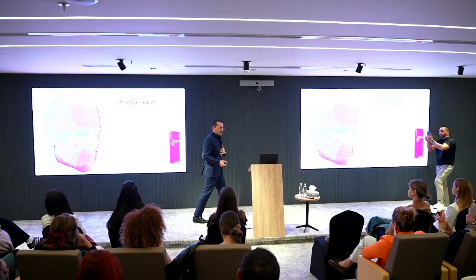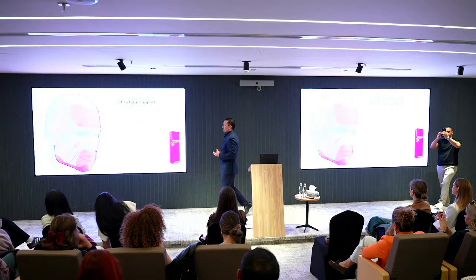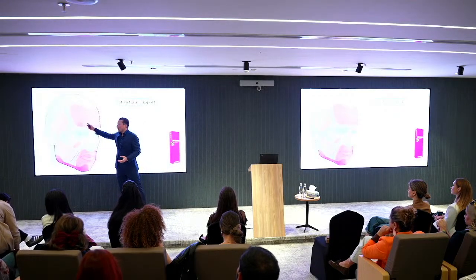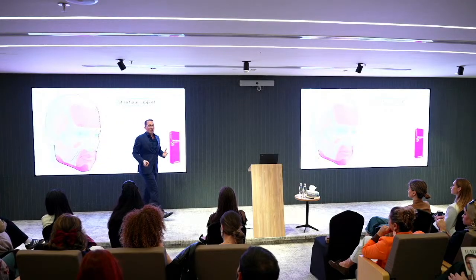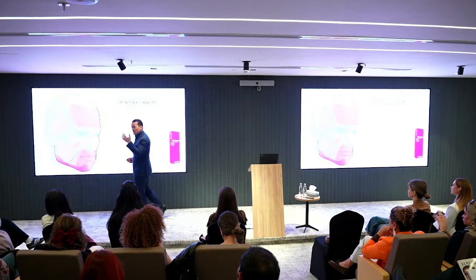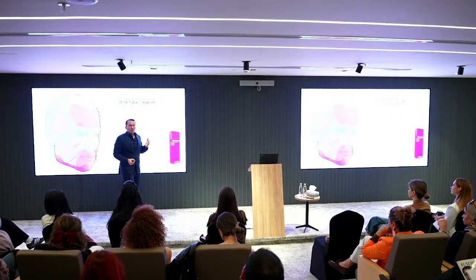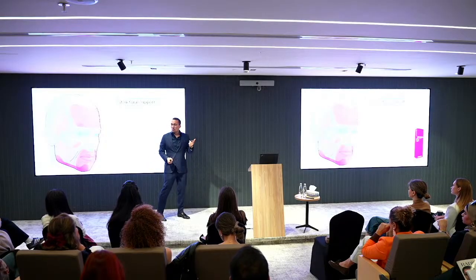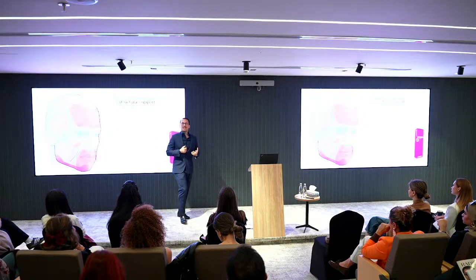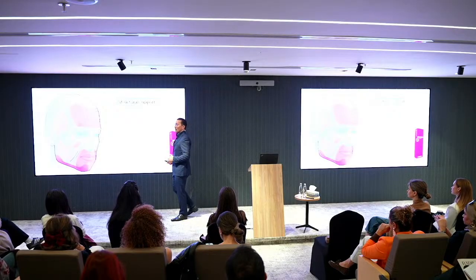Why? Because it resists deformation, it resists certain pressure that sometimes I need in certain areas, like the forehead. If on the forehead you have an eyebrow which is a bit lower, a bit depressed because of volume loss, and I want to have an impact on the eyebrow position, I need a product which I can place under the muscle but will not be deformed by the muscle, which can resist the pressure of the muscle. For me that's a yes. Give back the volume and we'll be able to lift the eyebrow, right?